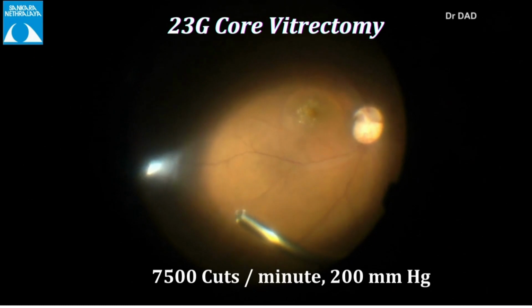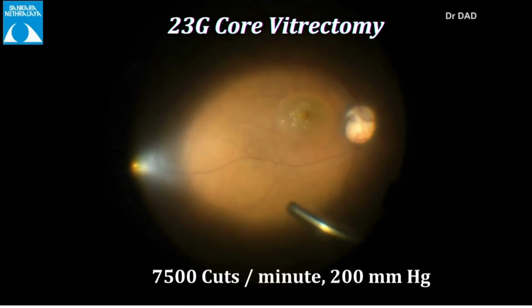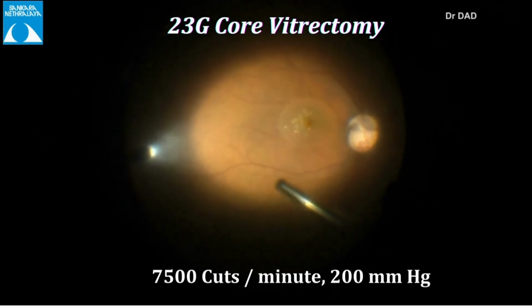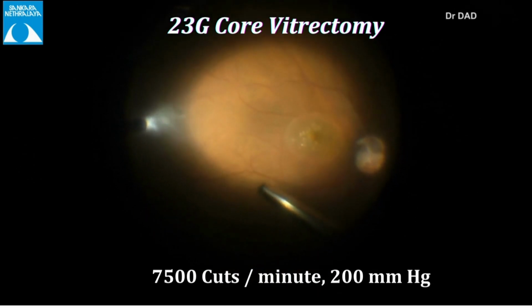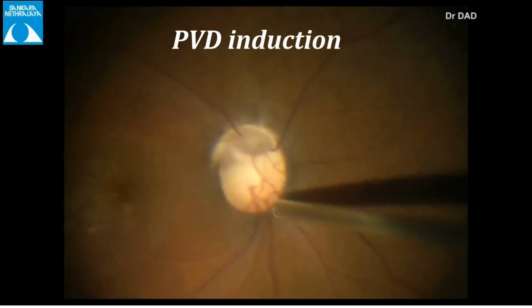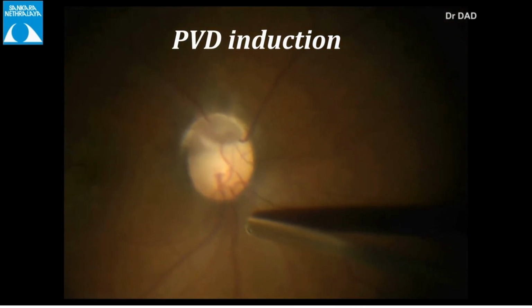A standard 3-port 23-gauge pars plana vitrectomy was initiated. Core vitrectomy was done with a cut rate of 7,500 cuts per minute and a vacuum setting of 200 mm of mercury. PVD was then induced using a vitrectomy cutter from the disc as depicted.